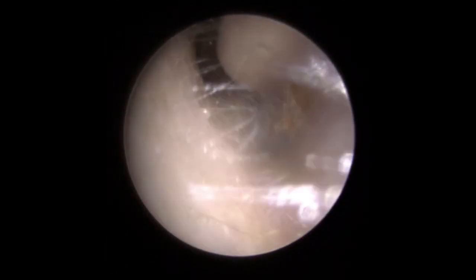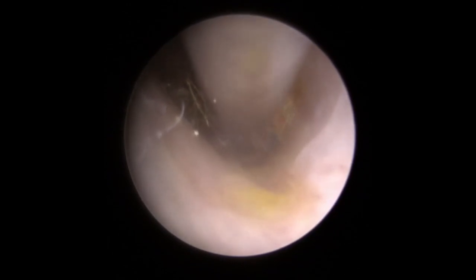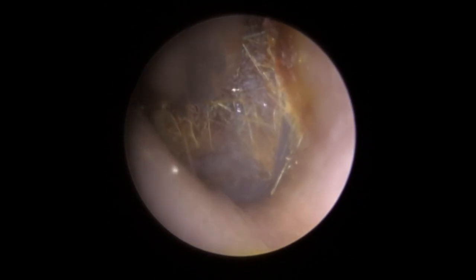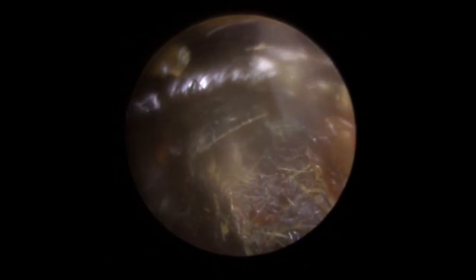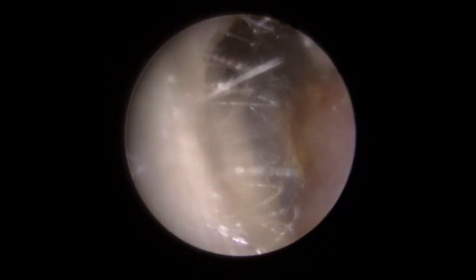These are always really tough ones to remove because with the use of the Q-tip, you've compressed a lot of the wax together, so it's formed quite a hard layer. And then you've also got these surrounding areas which are really firmly stuck to the canal wall. So that whole section is one piece, but we're not going to be able to get that deeper section away without taking this front section away first.